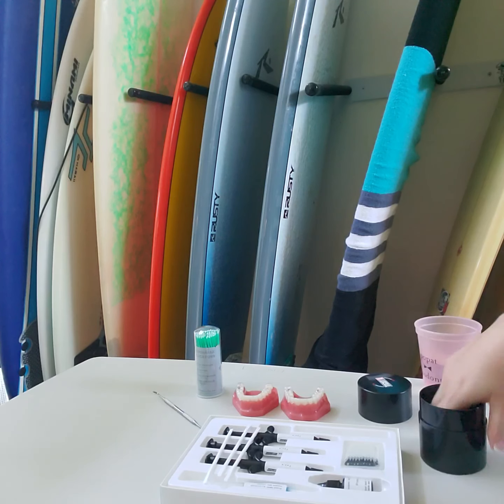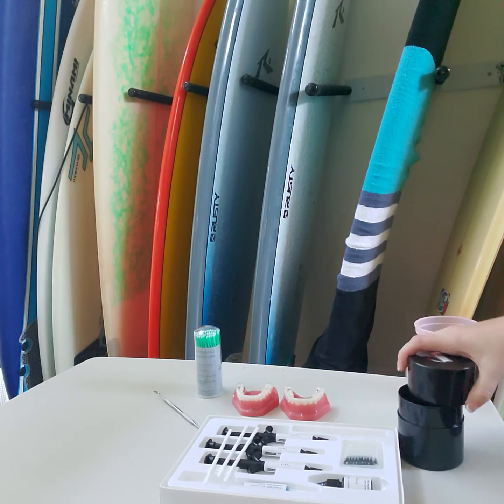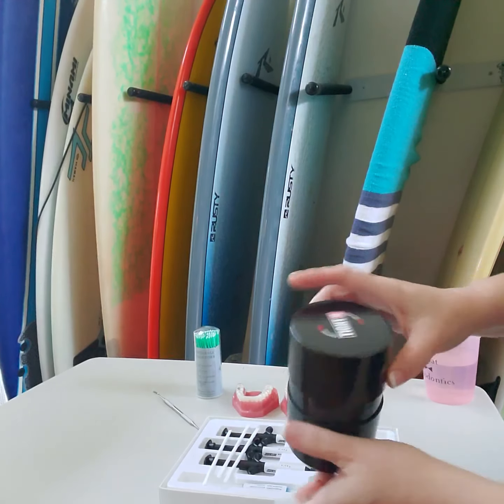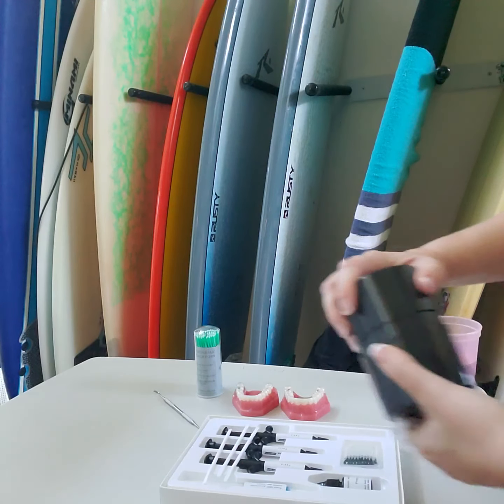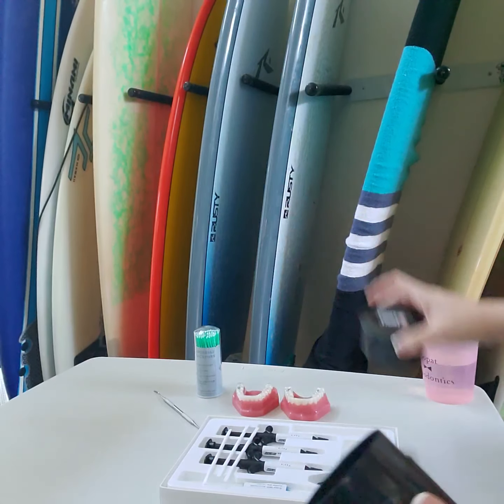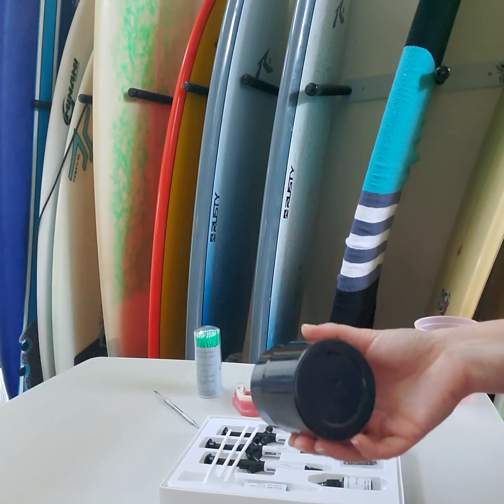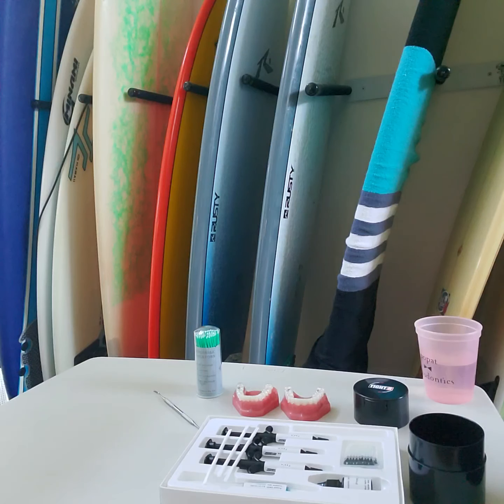I'm going to go ahead and get my trays. This is a little investment. You can buy this at any cannabis dispensary or you can actually buy it at Amazon under cannabis products. We're not using cannabis, but this tight vac is really great because it's totally air sealed and also light sealed. So I like to prep my trays ahead of time and throw them in one of these. You can actually leave them in these for days. But maybe I'll do it in the morning and just leave it in there, put the patient's name on top, so when it's ready for delivery, we're ready to go.